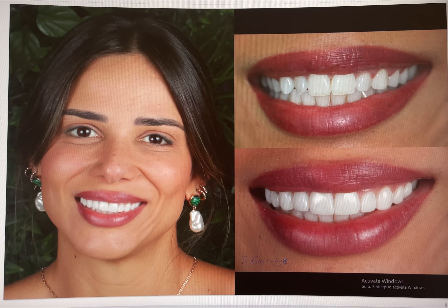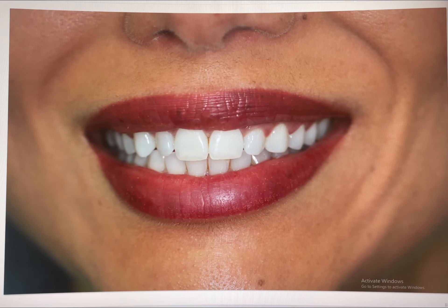We have a stunning patient looking to add a few touches to her already very nice white smile. In this case we did no-prep veneers, where we do not touch the teeth and just cement veneers directly over the healthy and well-aligned teeth.